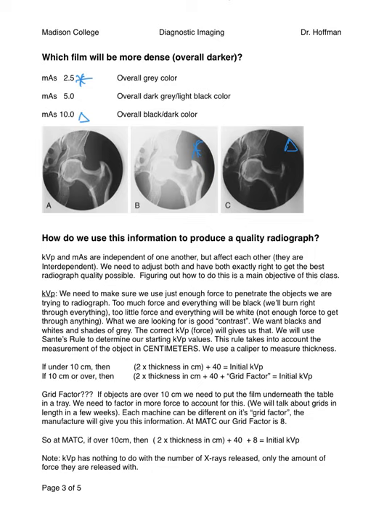So note, on the first ones that we looked at, we really saw a difference with the penetration power. We saw x-rays that were really white all the way up to ones that were completely black. This one, you're not seeing that drastic of a change, but you're definitely seeing your blacks get blacker as you go through it. And again, there's going to be an ideal force, and there's going to be an ideal MAS that we're taking our x-rays with. And we get to spend the next 16 weeks learning how to do that.